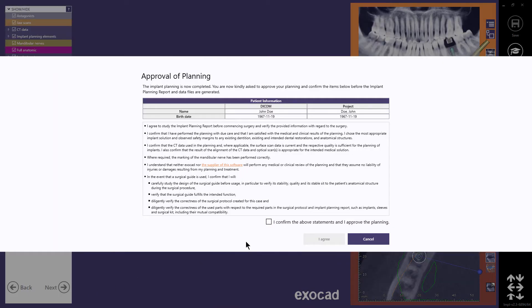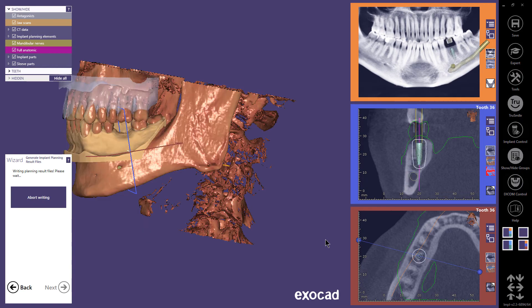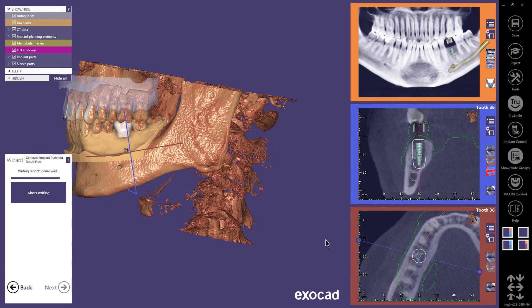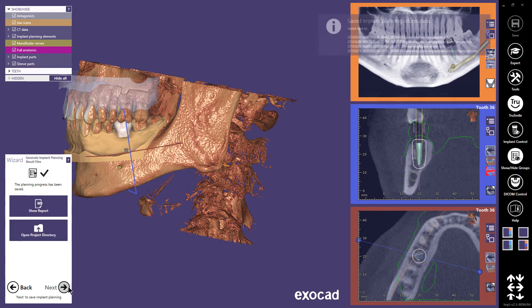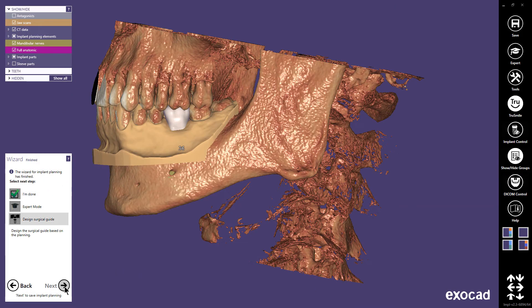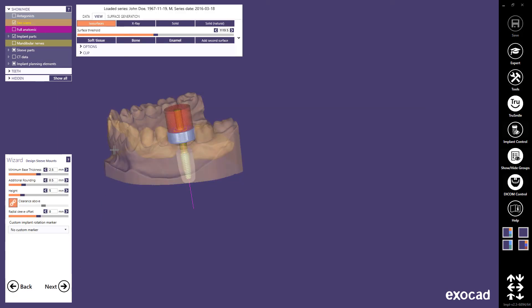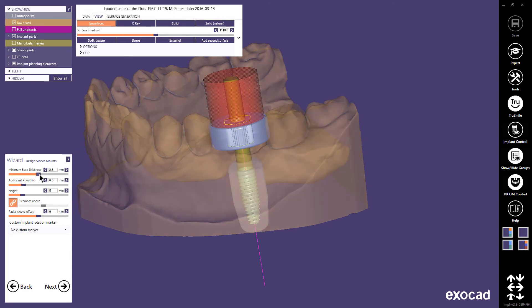I continue with Next and it is time to approve the planning. When that is done, the planning result files are written and the implant planning is finished. I can now select to continue to the surgical guide design. Please note that manufactured surgical guides for endosseous dental implant placement are classified as medical devices by the FDA. Version 2.3 and earlier versions are not to be used for edentulous patients or patients with insufficient dentition that do not allow a stable fit of a tooth-retained surgical guide.